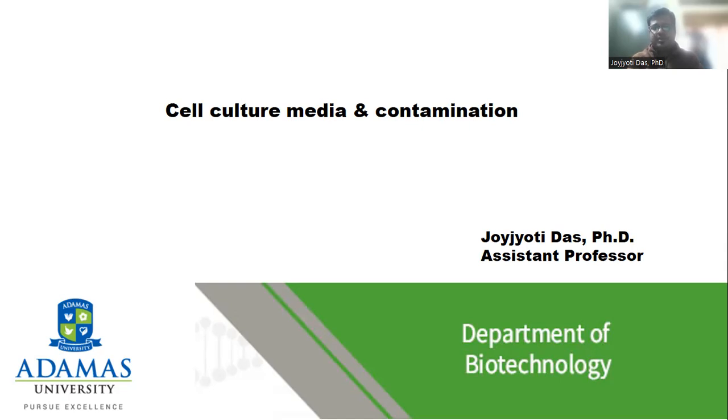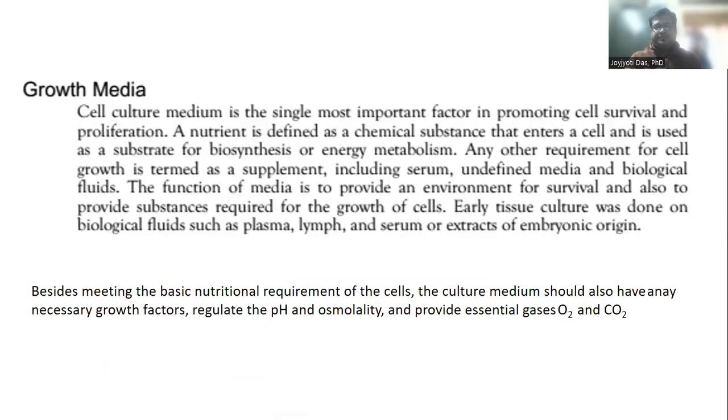In this lecture, we are going to talk about the food for the cells, which is called the cell culture media. So let's start with the definition of growth media. From microbiology, we all know that a cell culture medium is the single most important factor in promoting cell survival and proliferation, let it be bacterial cells or animal cells or plant cells.